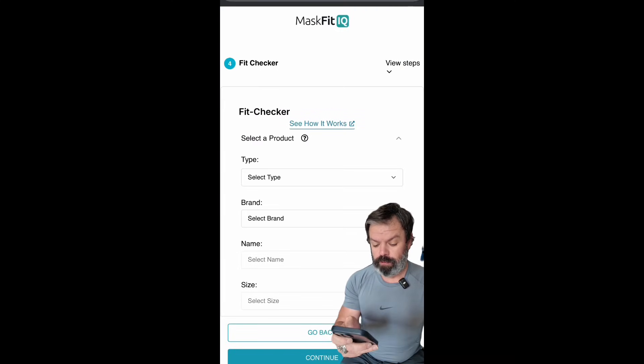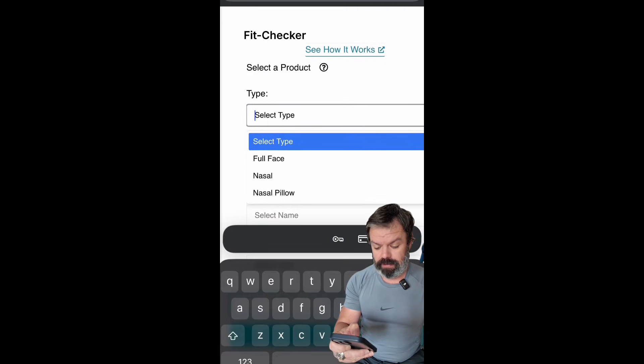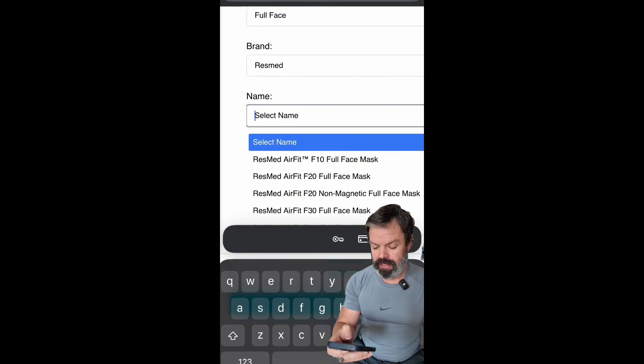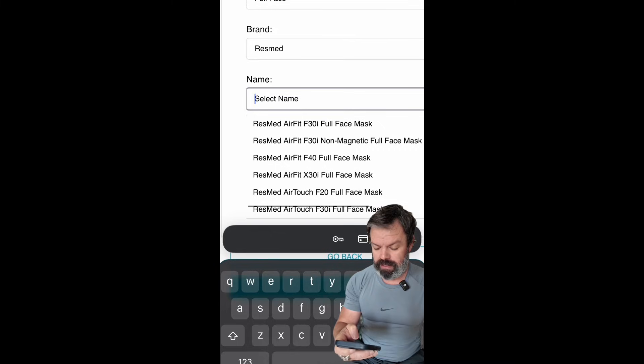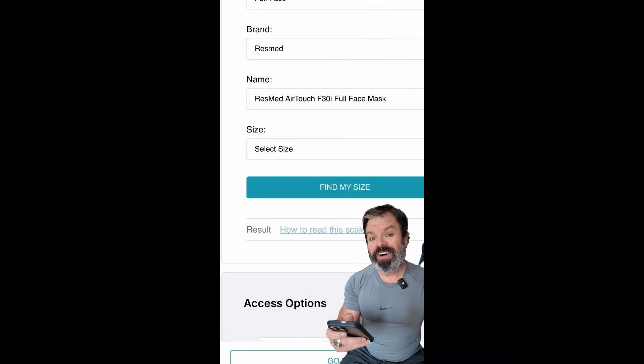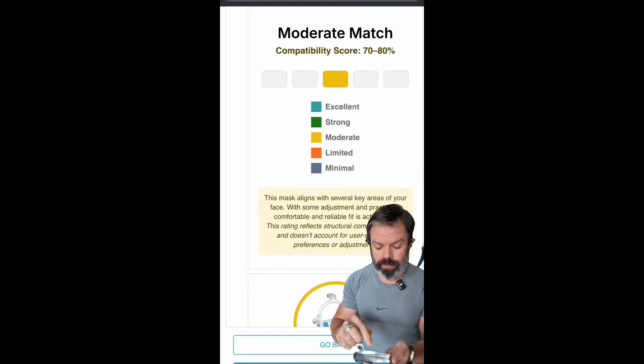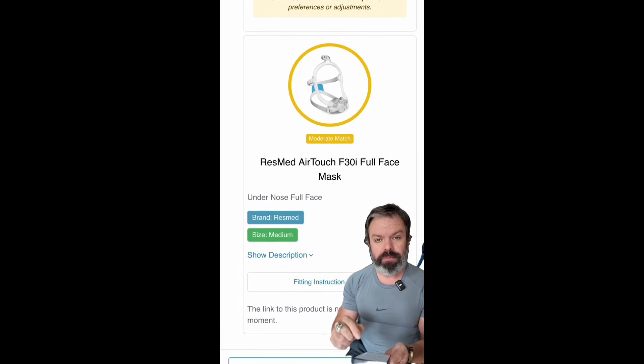I want to show you the easiest way to fit up any CPAP mask with MaskFit IQ — let's do it on Uncle Nico. For type, we'll choose full face mask. For brand, ResMed. And the name is the AirTouch F30i. Down the bottom here, find my size. And just like that, I have a moderate match for size medium.